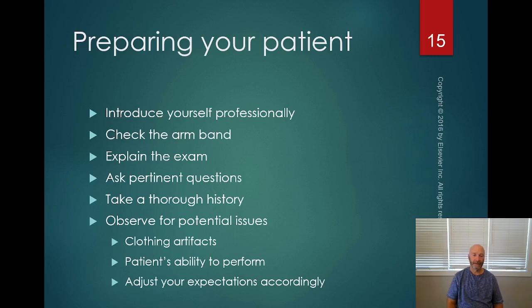But consider also the patient's ability to perform. If you bring a patient to the x-ray department in a wheelchair, you might want to take a look and see if they have any legs before you ask the patient if they can get onto the x-ray table. But also consider, just in observation, take a look at the patient. If you have a patient who's kyphotic, meaning that they're kind of hunched over, and they're older, then there's a very good chance that they have multiple compression fractures in their spine, which would be painful for them to lay flat on their back on the x-ray table. They might not be able to lay flat on their back on the x-ray table at all.